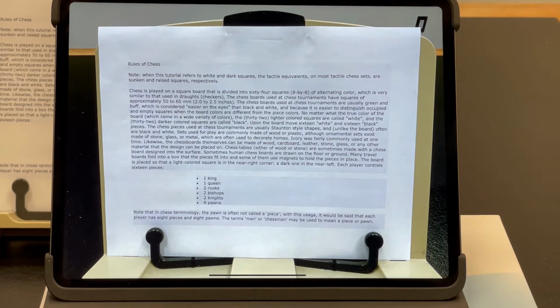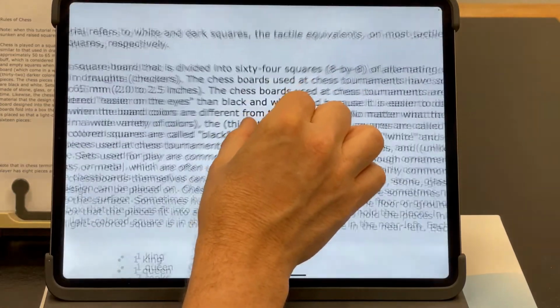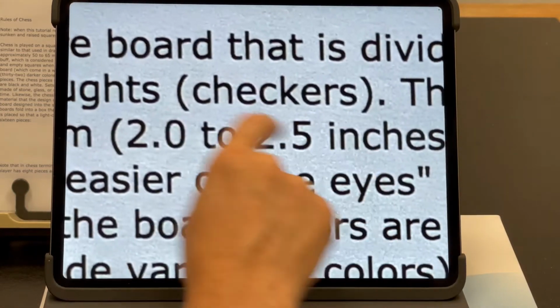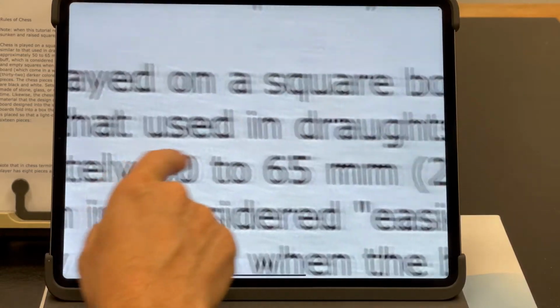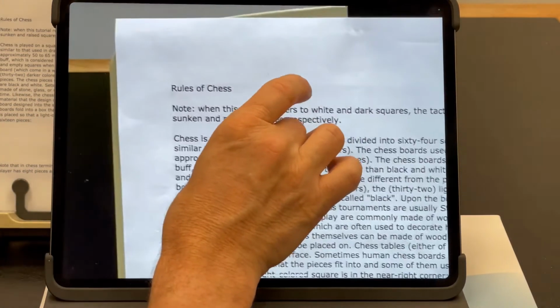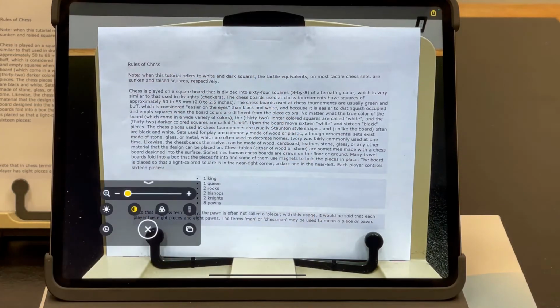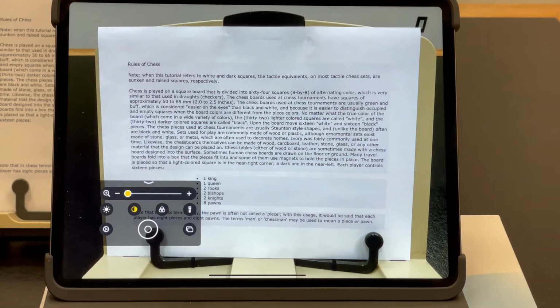The controls are hidden. And while I'm here, note that I can pinch outwards on the image and just drag with a single finger in any direction to pan across the image. To bring the controls back, first I'll zoom out, touch the image in the middle, and touch the X in the circle to go back to live view.